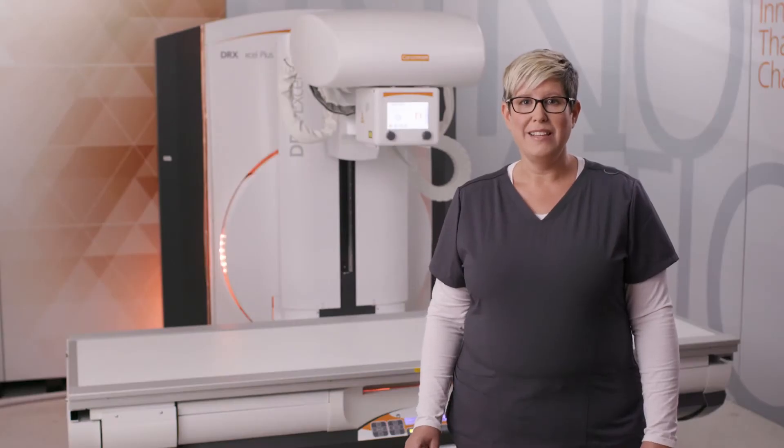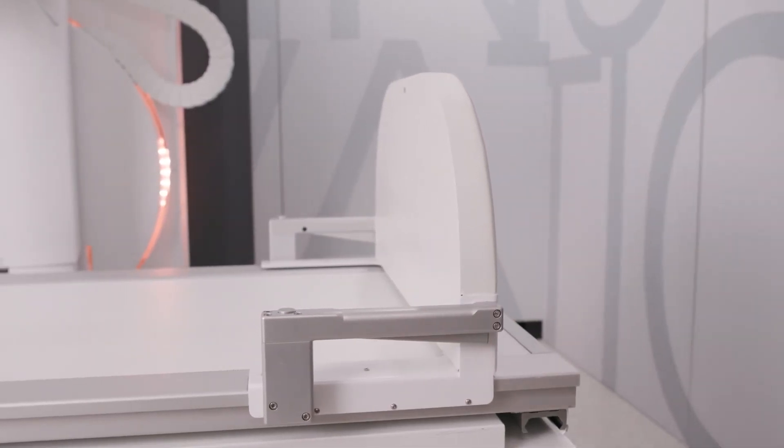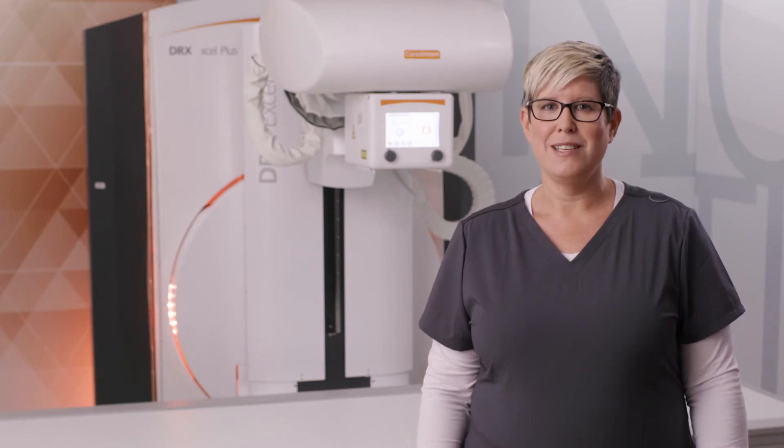Both the table and the optional footrest can support up to 265 kilograms, accommodating heavier patients without any limitations to the table movement. The system design allows for full patient access from both the front and back side of the table, which means easier patient transfer and versatility of exams.